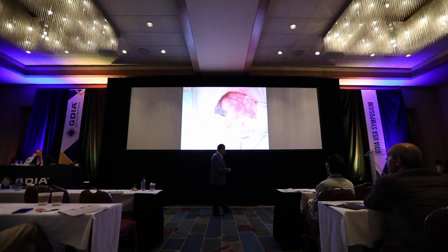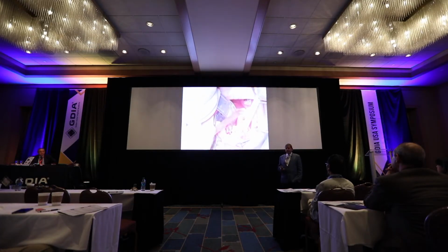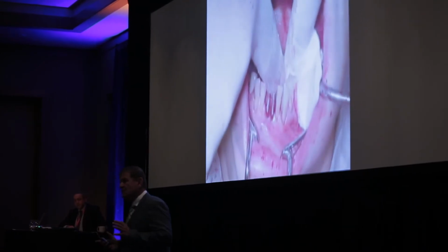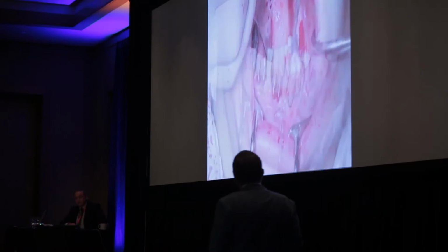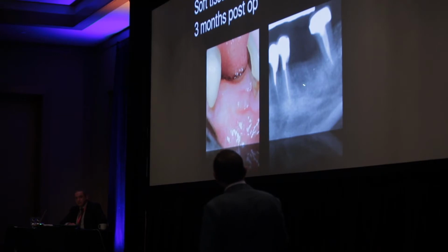I continue to augment. I use here the 3D Bond because I had enough bony wall surrounding. So for me, it was important to say, let's first stop the bleeding, and then whatever I gain, I gain. Even if I have loss of volume, at another time I can re-augment. But you will see very shortly, by the way, primary closure is essential. Don't leave it open. 3 months later, this is the soft tissue appearance. This is the new bone that was formed, and this is the re-entry. 100% the patient-owned bone.